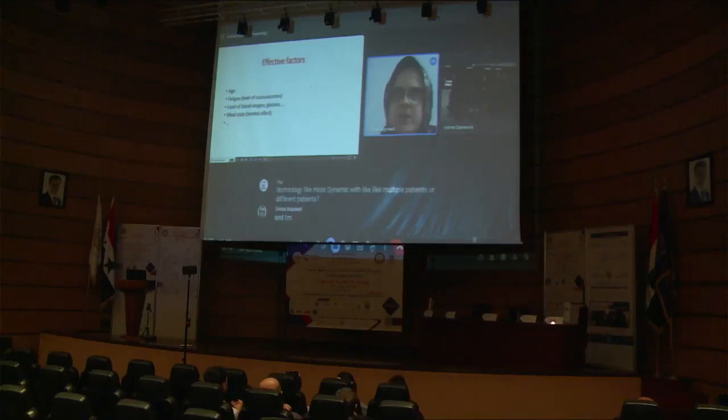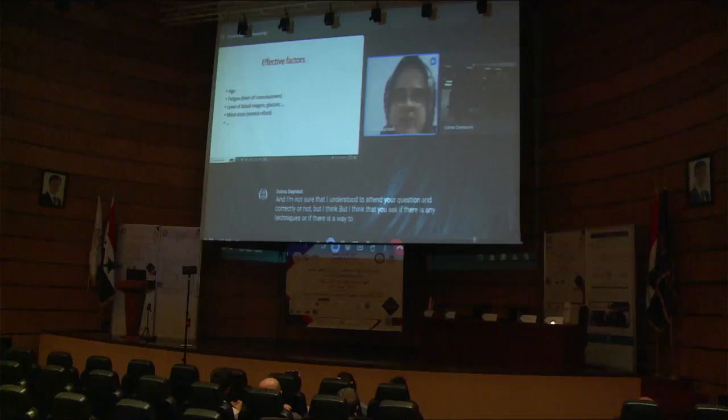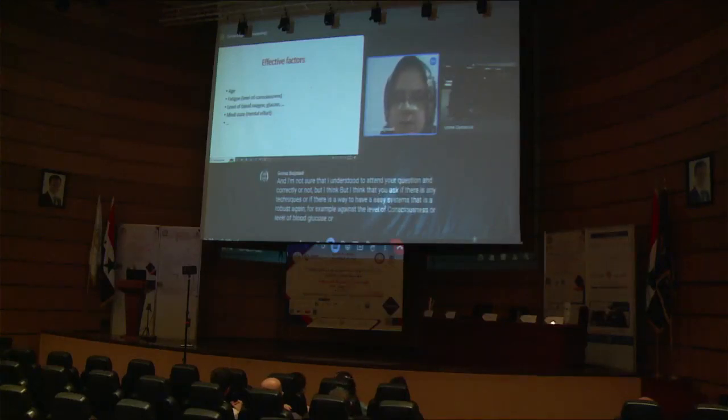I'm not sure that I understand your question correctly or not, but I think that you asked if there are any techniques or if there is a way to have EEG systems that are robust against, for example, the level of consciousness or level of blood glucose or mind states that are transient or can be removed in a short period. If your question is this, it's very hard because your EEG dynamics can change by these factors.